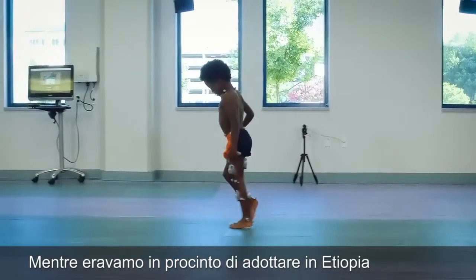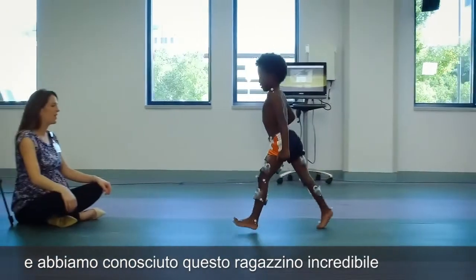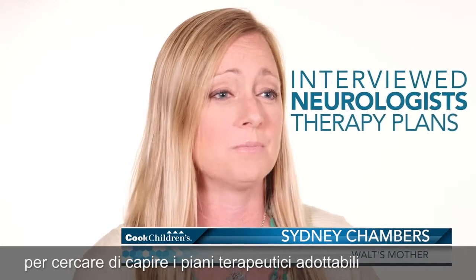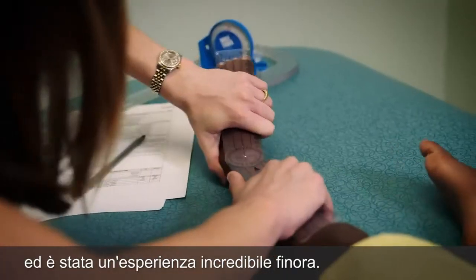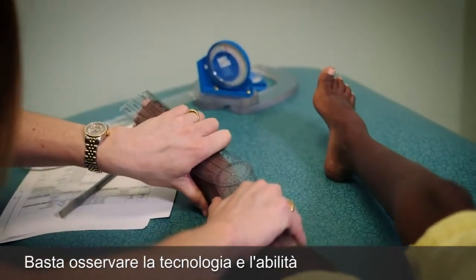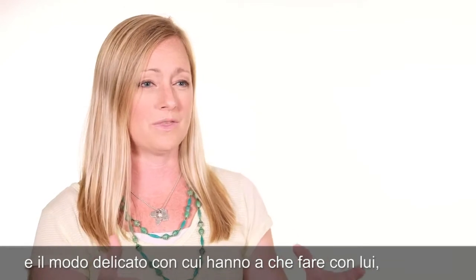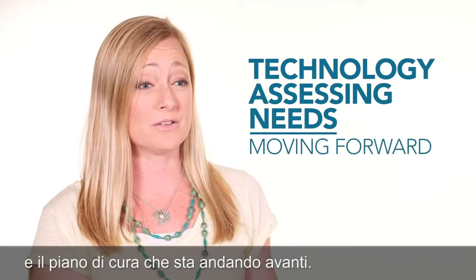We found out about Walt. We were in the process to adopt from Ethiopia, and we were on a very long wait list, and we found out about this incredible little boy that had some special needs. We reached out to Cook Children's before he was even home, and we called and started interviewing neurologists and started trying to figure out therapy plans and what our future potentially looked like with him. So today is our first time here at the Motion Lab, and it has been an incredible experience so far, just seeing the technology and seeing the ability and just the kind way that they're dealing with him, but getting to see physically what he needs and what the plan of care is moving forward.